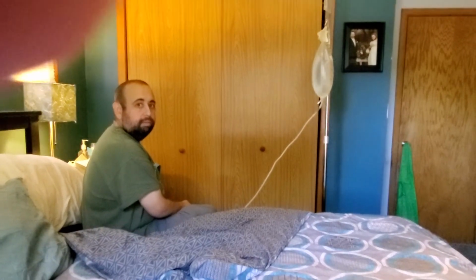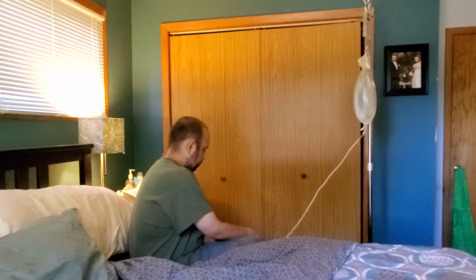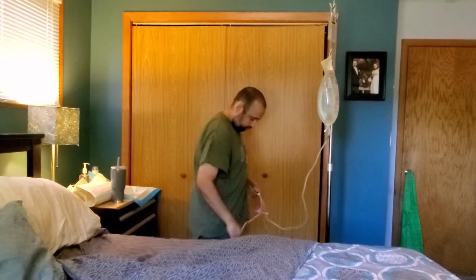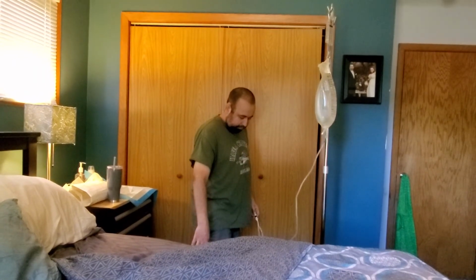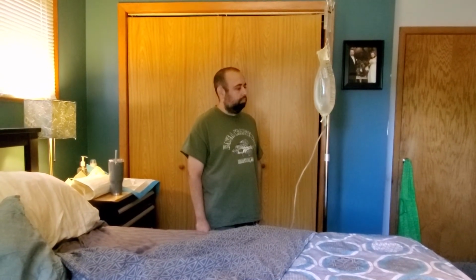All right, so he just did his initial drain, which didn't pull out much from him, so he's going to get ready to do the fill. Unfortunately, with the drain, he's experiencing a lot of drain pain, so much so that they took an x-ray to see where the catheter was placed, because it's likely that the catheter might be placed next to a nerve, or by the colon, or too close to the bladder, so that when he opens it to drain, there's quite a bit of pain. They also said if it was by the nerve, it could possibly just go away on its own, but it's been so long now that we're a little concerned about where the catheter is placed. So that's kind of a bummer, but hopefully we'll get that figured out soon.